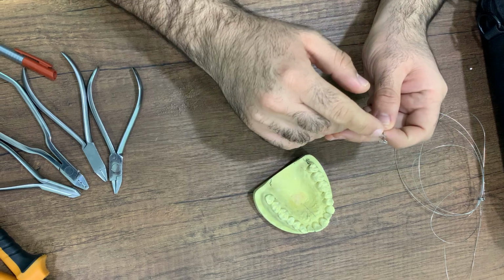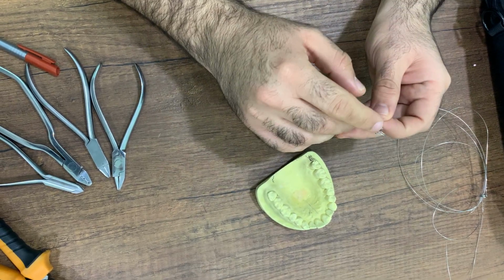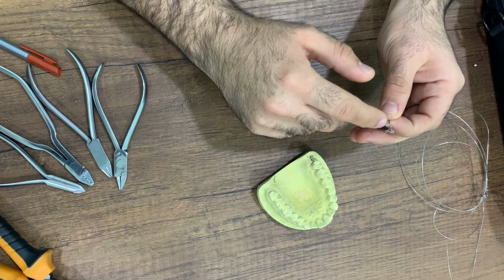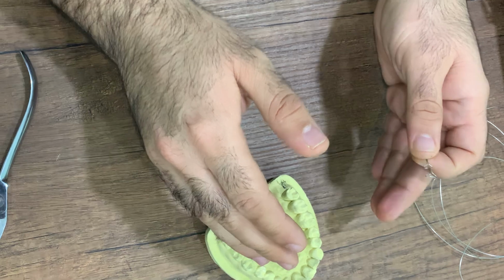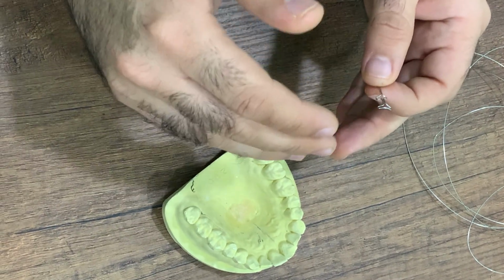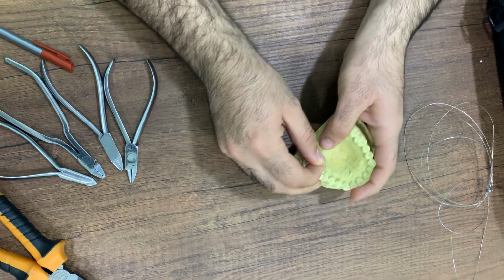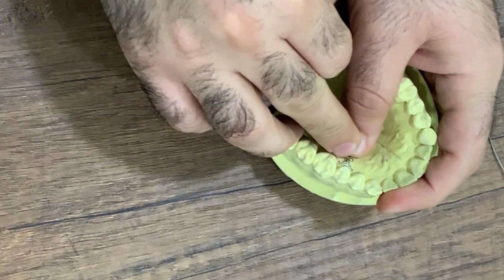Today our lab is about T-spring. In this lab you will learn wire bending of T-spring. Now I will give you some information about the T-spring including definitions, uses, components and activations of T-spring. T-spring is a palatally situated active component of removable orthodontic appliance.